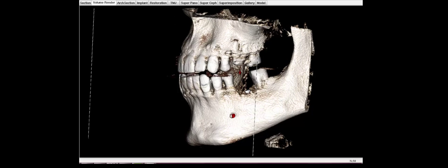I'm also looking for other pathology like in those upper teeth that I mentioned that are eventually going to be extracted on this patient. There are areas where the root canals are failing. Those are those little black spots up in the bone. Those are not healthy root canals there that have those black spots up there.